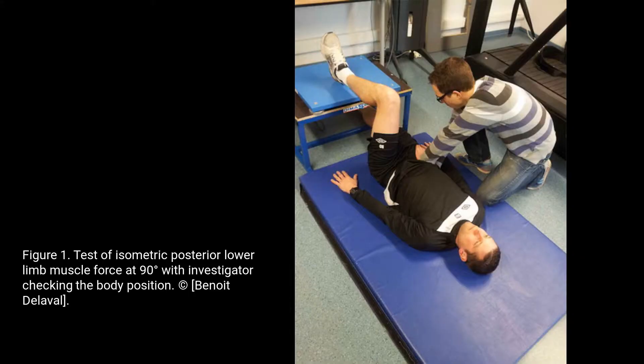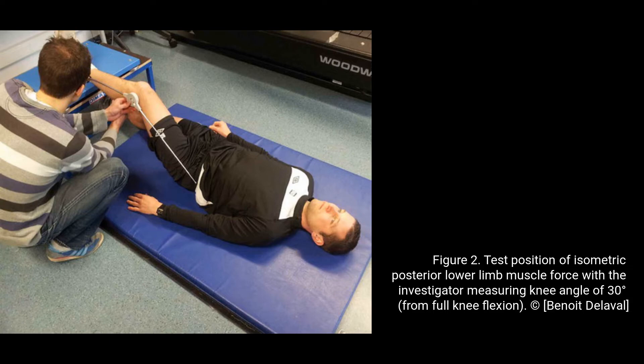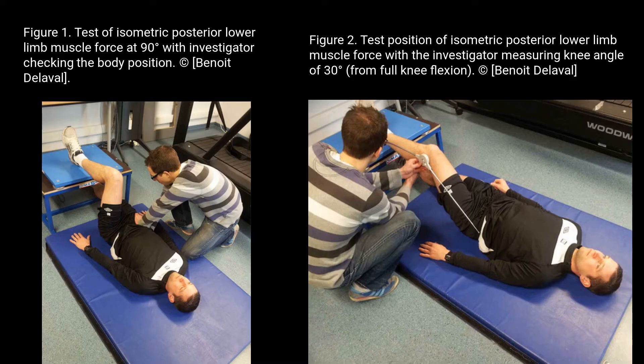With the McCall 90-90 test, we prop the force plate up on some sort of step or box, and you want that at a consistent height and position every time. It has been recommended by Alan's study to use two positions: firstly the 90-degree position — 90 degrees of knee flexion from full knee extension — and also a 30-degree position. In the 90-degree position, the semimembranosus and semitendinosus are maximally activated, whereas in the 30-degree position of knee flexion, the biceps femoris is maximally activated. The non-working leg is in a relaxed, straight position, ideally under the box so it doesn't interfere.